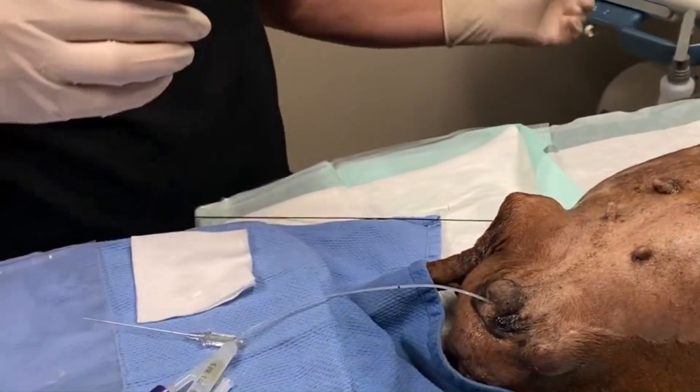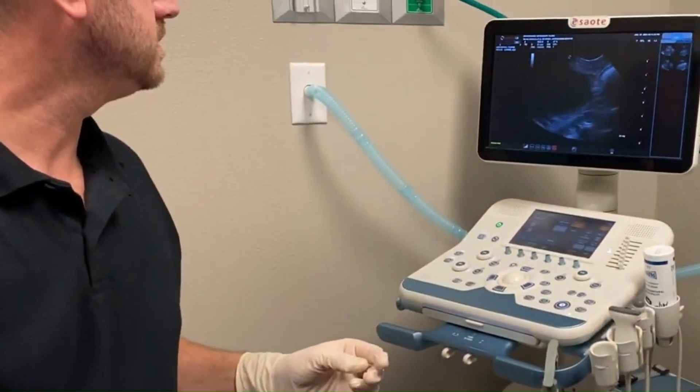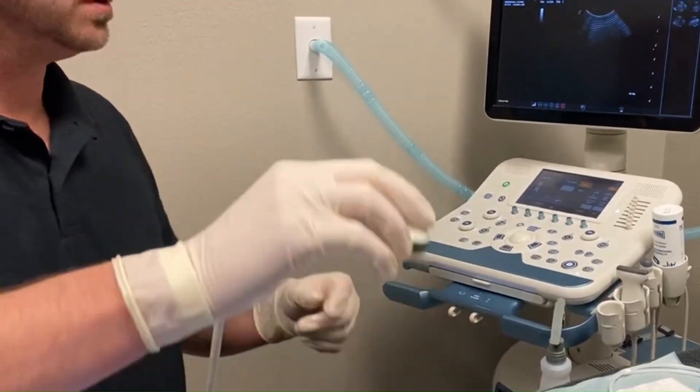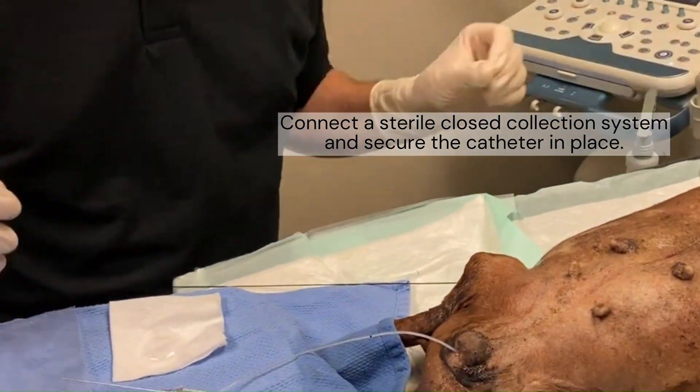And I know that I'm in the bladder. I'll show you with the ultrasound — there it is in the ultrasound, in the bladder. And I will inflate that and suture it in. There it is.